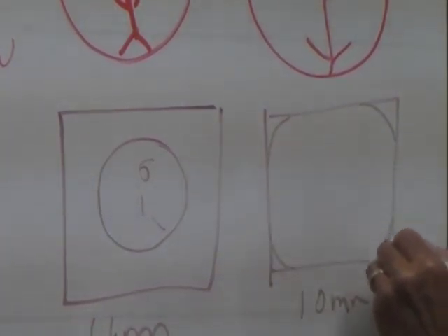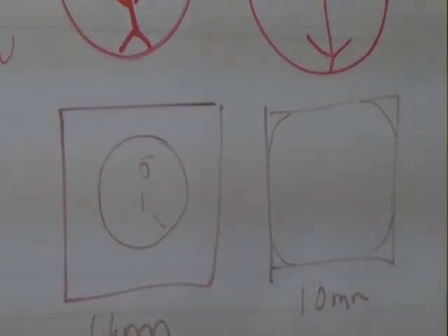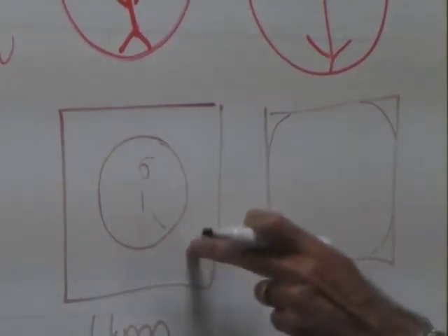is this big... So will it crop like that, or can you pull back so that you can see there's nothing other you can image? No, it will crop like that. Okay. You can change things by changing the camera system or changing the video coupler. Or if you had a zoom coupler, you can change it. But for this exercise, keeping everything the same, this circle will be bigger than this circle.